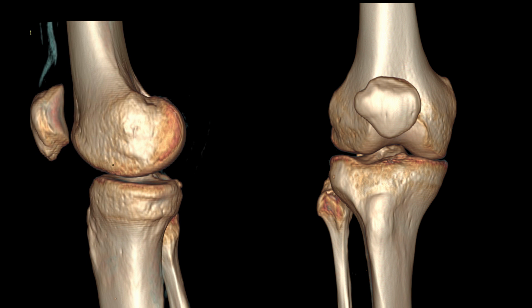First, the bone landmarks. On the femoral side, you can see the relatively large bony prominence of the medial epicondyle, and on the tibial side, under the posterior portion of the tibial plateau, you can see a groove where the anterior arm of the semimembranous tendon inserts. At the joint line, we can see the entire periphery of the medial meniscus.